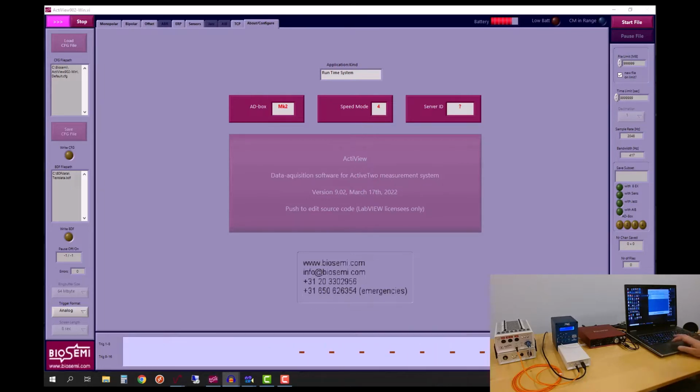So on the EEG software, you'll see these individual instances of the sound represented as TTL raised bits on pin number 9. If I switch this trigger format to decimal, you'll see that that is represented here as a 1 followed by 0. That's just in the context of triggers 9 through 16. So in fact, in your data file, that is the middle byte of a 24-bit channel. So in ActiveTwo, you have to do a little bit of masking of bytes in order to be able to interpret that as a 1 followed by a 0.